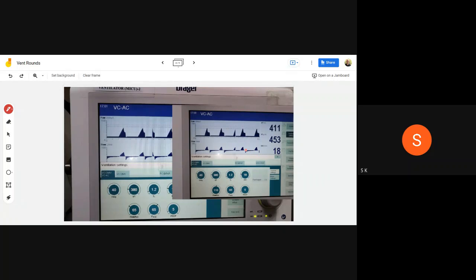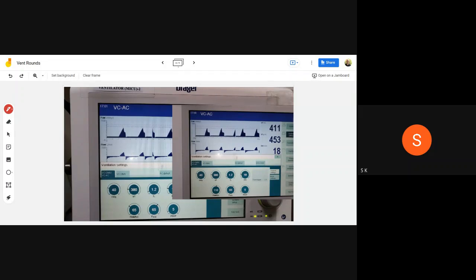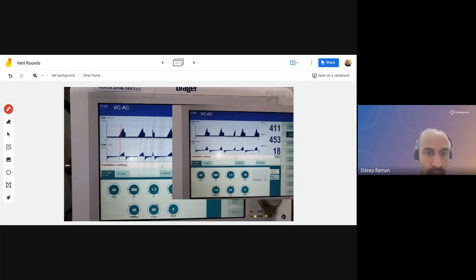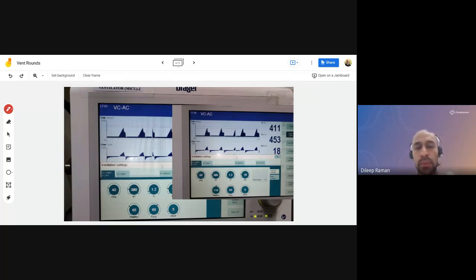What I wanted to ask was, is there any corresponding flow that can be estimated for the given flow acceleration that we set? Yes, and that is a dependent variable, and the flow is measured in real time as the pressure is increasing. At each point in time, the correlates of the increasing pressure are shown on the graph as a flow, not as a number. You will have to freeze the frame and then dial and see what the number is.